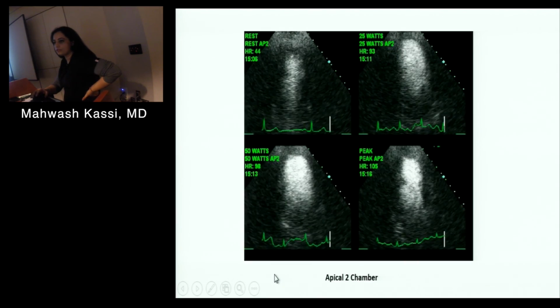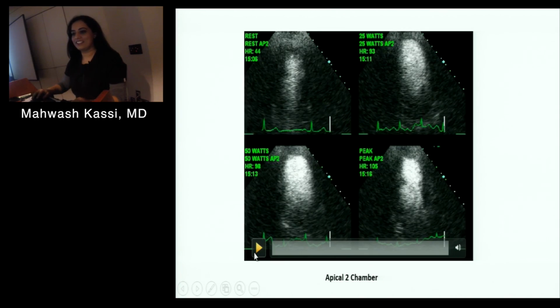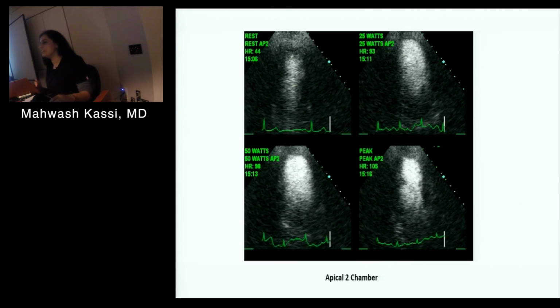You've got to pick on somebody else on the two-chamber. John, since you're the only other first year here. I'm glad that you think that second years know this. Yeah, I'll tell you. No, I want to survive in this program for another year, so I'm not going to pick on my own.